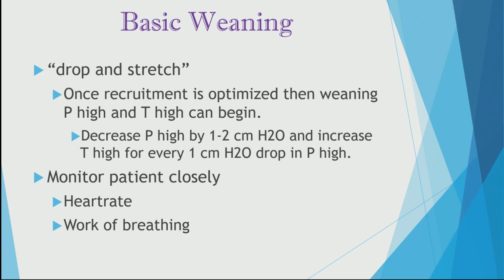You don't need to be in a hurry to do this, because oftentimes patients can be very comfortable on this mode of ventilation. So, do it every couple of hours. Don't put yourself back at the starting line. Don't de-recruit alveoli. Once this is done slowly, then take the opportunity to reduce your FiO2.